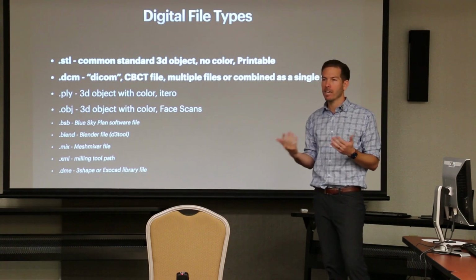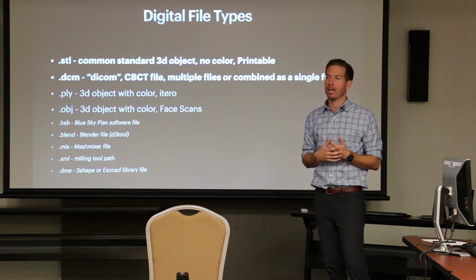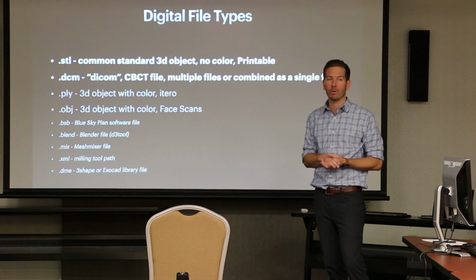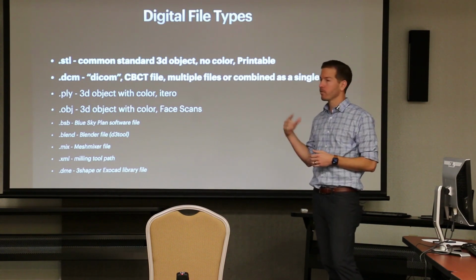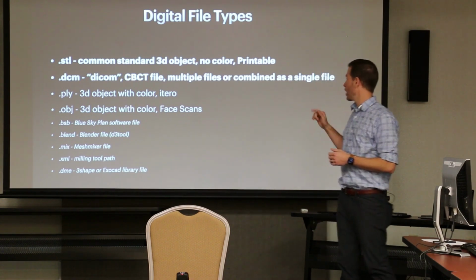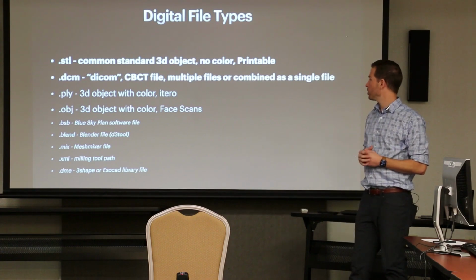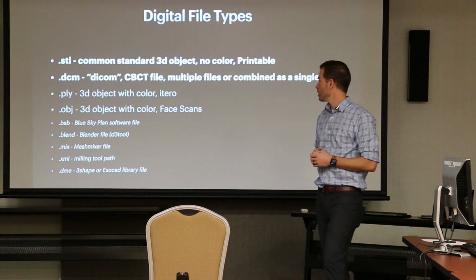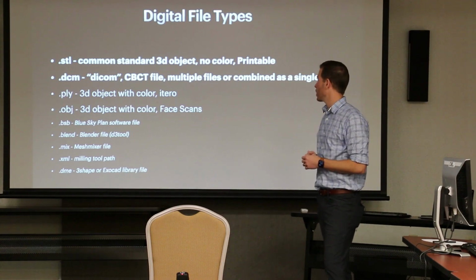That's what the iTero can produce. It's just easy to work with, and you can edit it in Meshmixer or whatever you want to do with it. So STL, that's from your iTero. DICOM, that's from your cone beam. So you guys are all getting cone beams or have cone beams already. .dcm stands for DICOM.